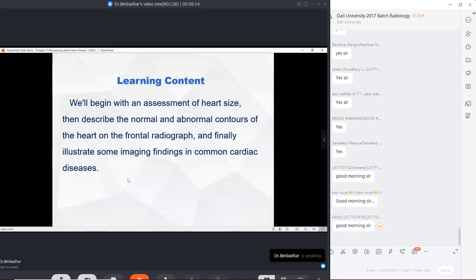It has a relation with its output, which is called the cardiac output, and with how much blood is released in every systole or diastole, either how much it is receiving or how much it is circulating. So ejection fractions and everything. We are going to look at the heart size because it gives us some direct evidence, and sometimes indirect evidence, of its real status.